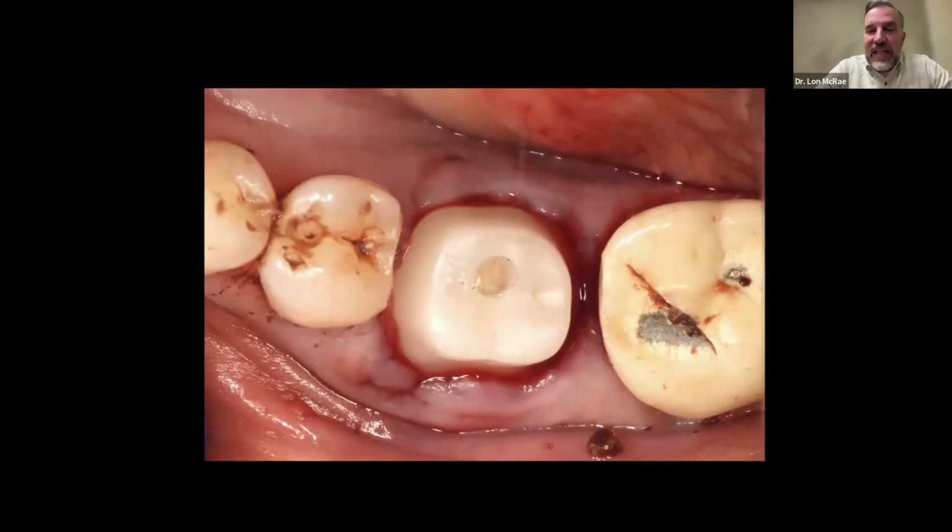Now, what do we want that final abutment to look like? I want it to look exactly like if I had prepped this tooth. I want to seal the entire socket, everywhere around it. If I can seal it, we end up with much less bacteria invading. We want it to look exactly like a tooth that had been prepped, so that if anything happened to the crown, any dentist, anywhere worldwide, can restore it. So this is the all-in concept: to finish these with this final abutment.